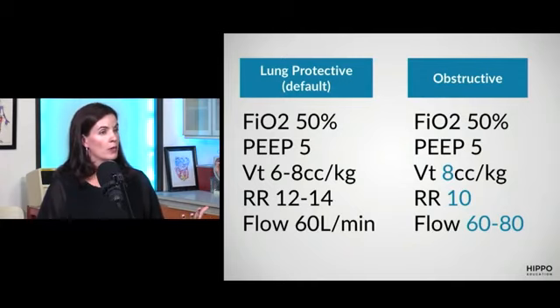Guys, can you tell me why would I want to slow it down in COPD patients? For me, the way I think about it is that they can contain a lot of air, but their problem is, I think of the wheezing. It's like they just can't get it out. So that's almost like breathing through a straw.